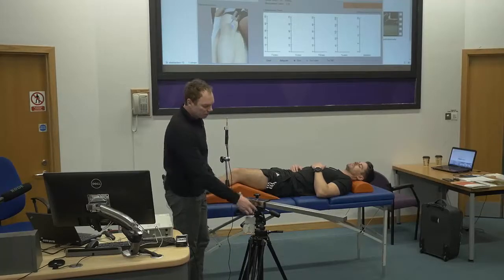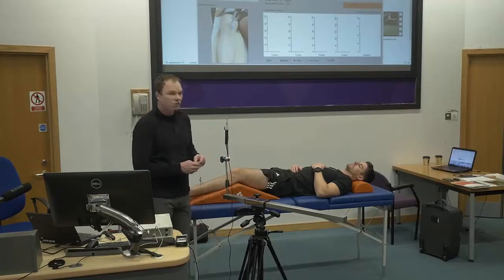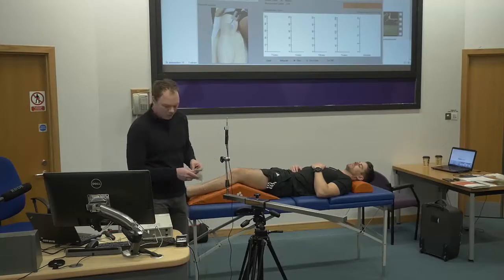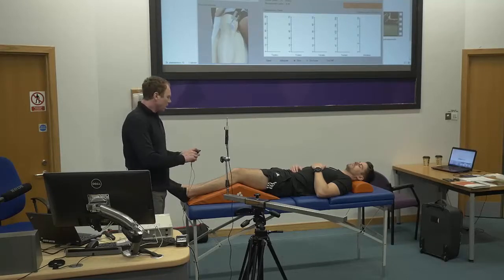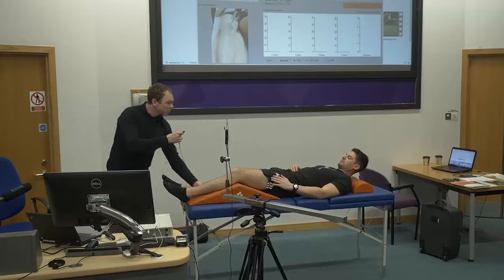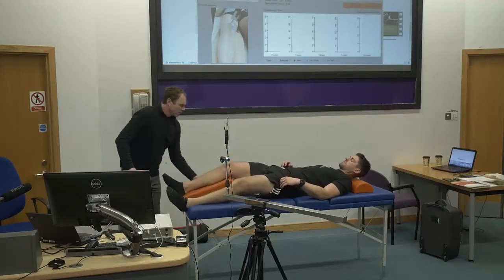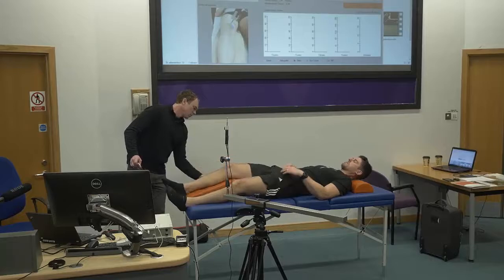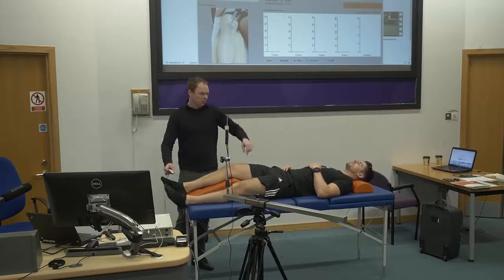The second thing you need to do is position the electrodes over the muscle belly that you will measure. We'll switch the legs so you will see a little bit more. We'll measure the medial head because you will see from the last row where the muscle belly borders are.